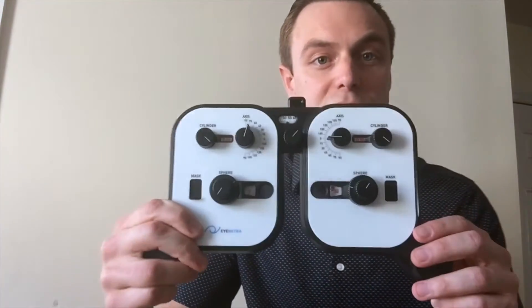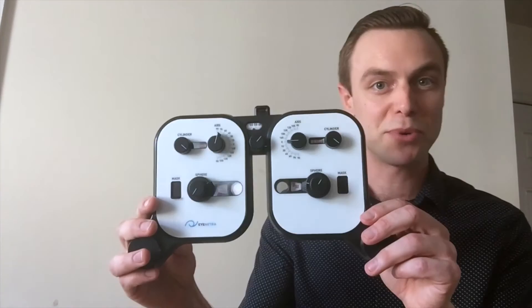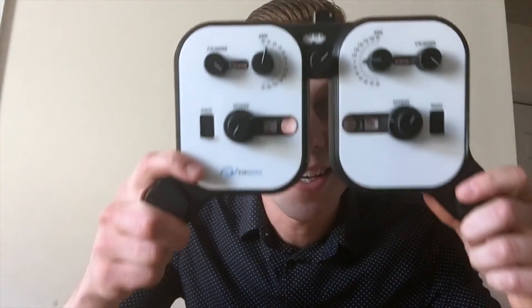And from here, the eye doctor could use the device controls to make any necessary refinements. That's EyeNetra's Netropter, a portable, lightweight, handheld phoropter. Available now at our store, store.eyenetra.com.